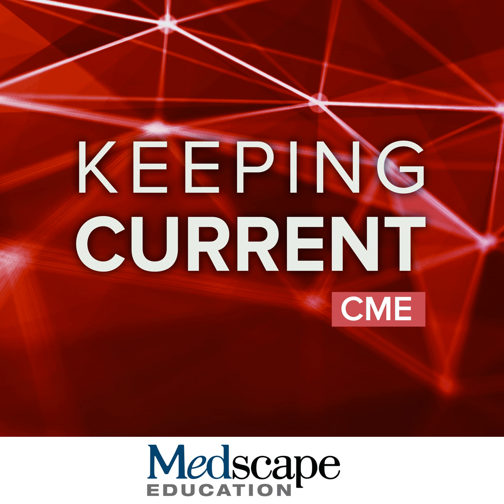So unlike in a chronic infarct or a mid infarct or most of the non-ischemic cardiomyopathies, where late gadolinium enhancement to the myocardium is typically telling us about fibrosis, in the setting of an acute MI, as in this patient, the late gadolinium enhancement is being retained because there's acute myocardial injury. So the myocytes have died because of ischemia in many cases, and that abnormal tissue is holding on to contrast. So I really like to emphasize the point that while we often think about myocardial LGE as being equal to fibrosis, that's not the case in very acute presentations like an acute MI.